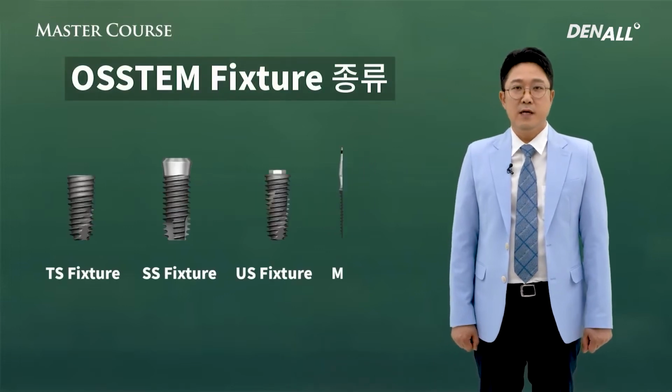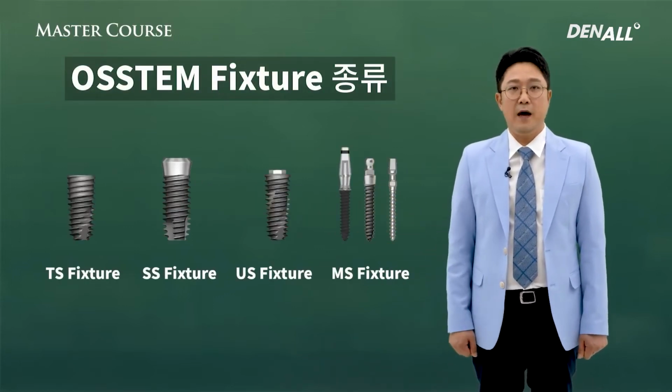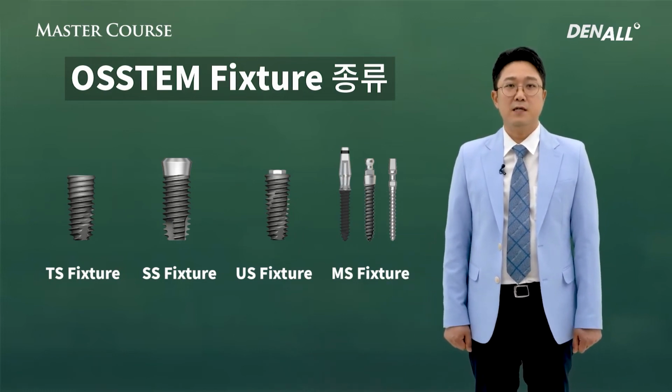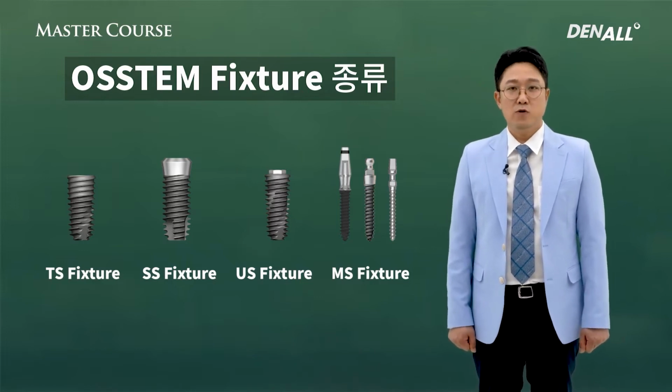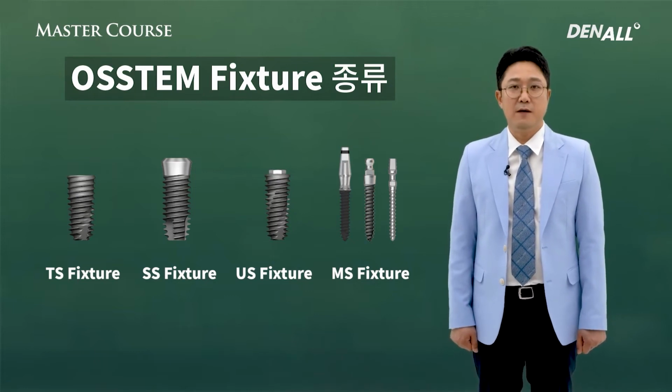Recently used fixture forms can be largely divided into 4 like this. Details will be addressed in Lecture 3 and Lecture 4. Today, I'm going to talk about the overview.